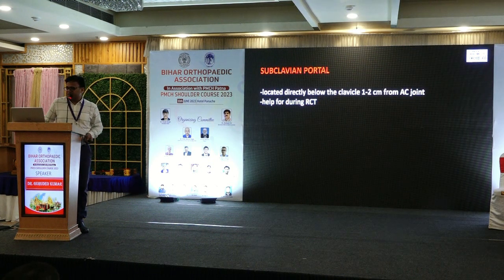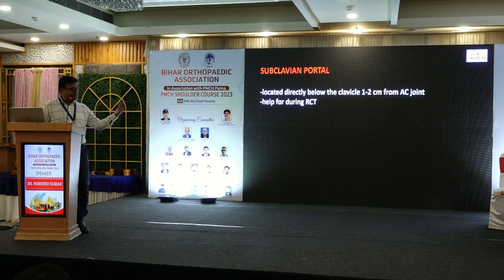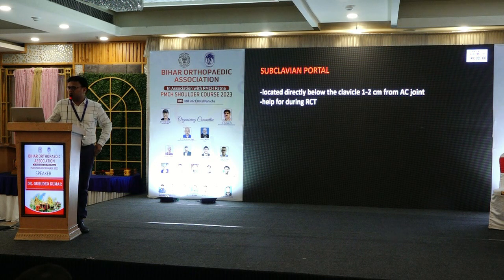And lastly, there is the subclavian portal. It is located directly below the clavicle, 1 to 2 centimeter lateral from the acromioclavicular joint, and it helps during the rotator cuff surgery.